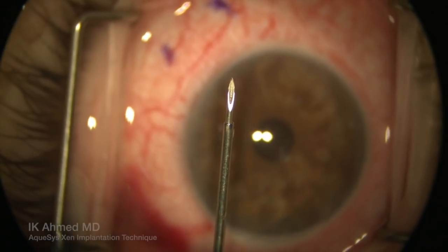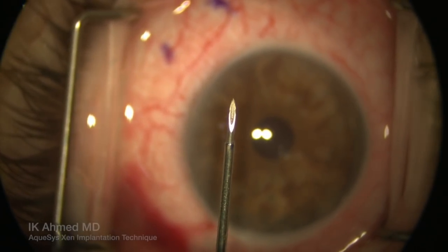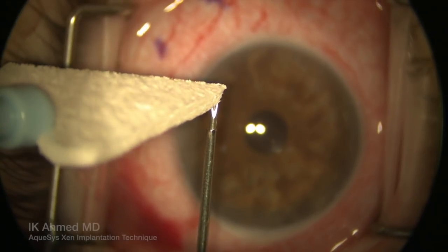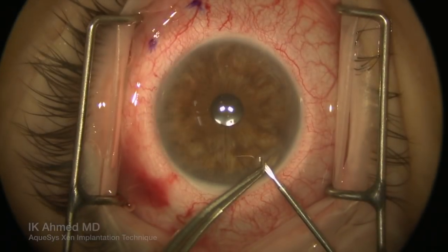This is a 27-gauge needle through which the implant is positioned. You see the metal sleeve around the needle itself, and there's the implant coming through the bevel of this 27-gauge needle.